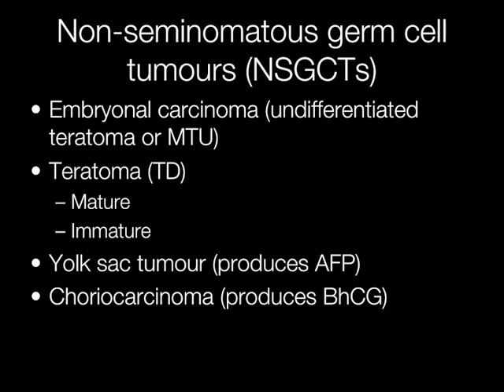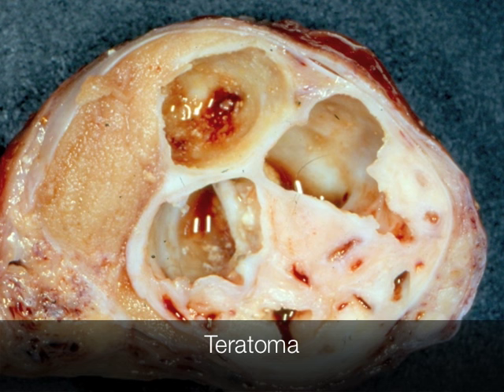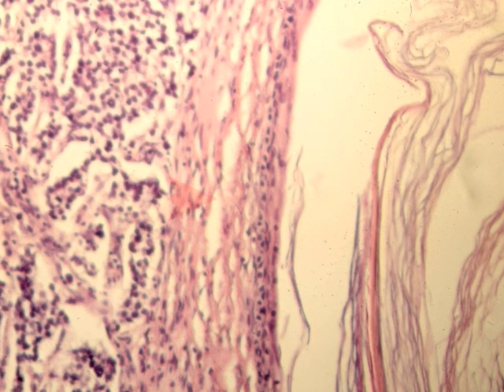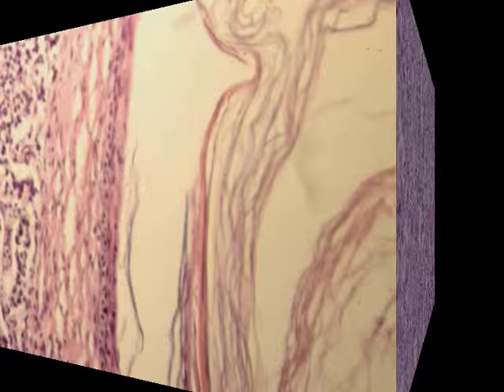This is the cut surface of a teratoma of the testis. It differs from seminoma in that it has a rather cystic appearance. This is a cyst lined by mature keratinising stratified squamous epithelium, and you can see the flakes of keratin on the right-hand side of the picture.